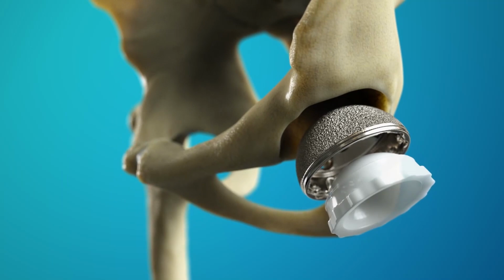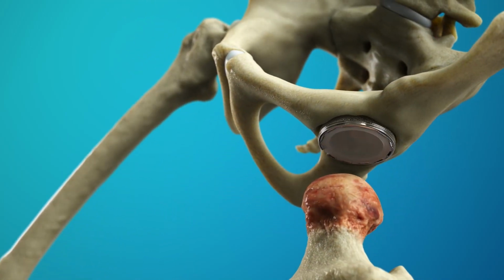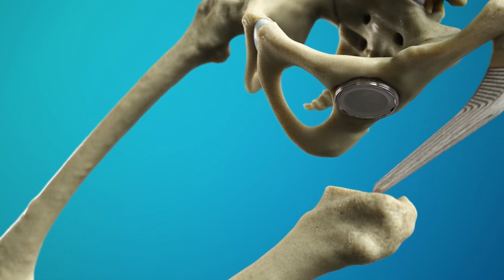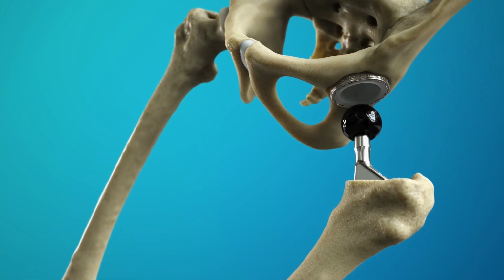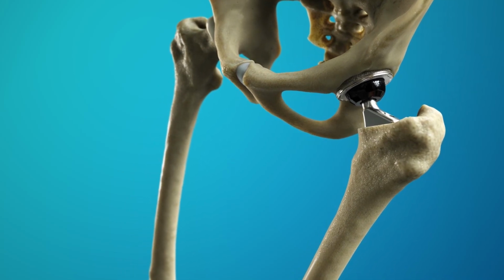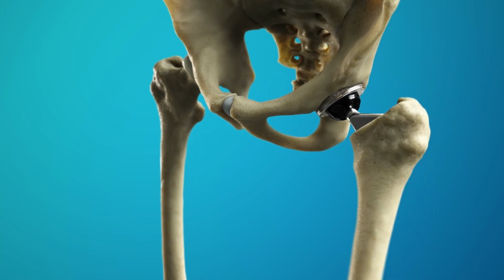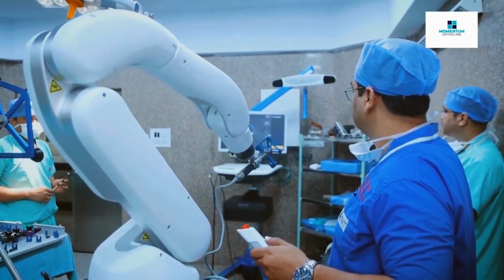The rehabilitation is accelerated. And whenever we need to do both sides hip replacement, we can do both of them together also, or one by one also. We need to decide on a case-to-case basis. For both hips to be done together, the hemoglobin has to be reasonably good, and we use a cutoff of around 50 years. If a patient is undergoing hip replacement below 50 years, and both hips need replacement, then we can do both sides hip replacement in the same sitting.